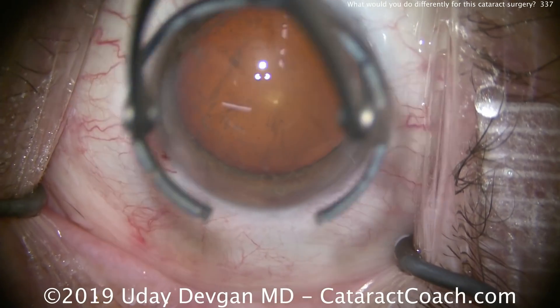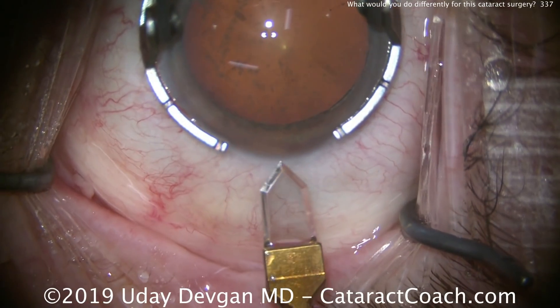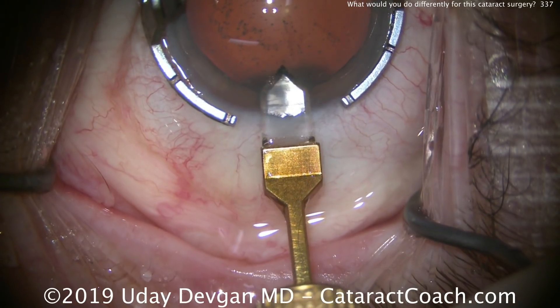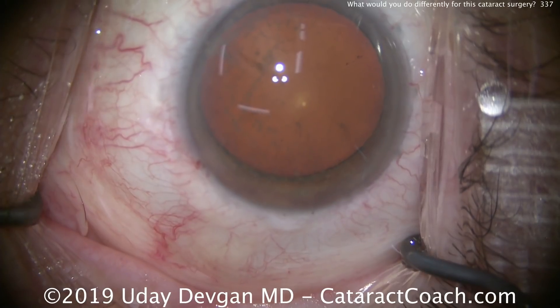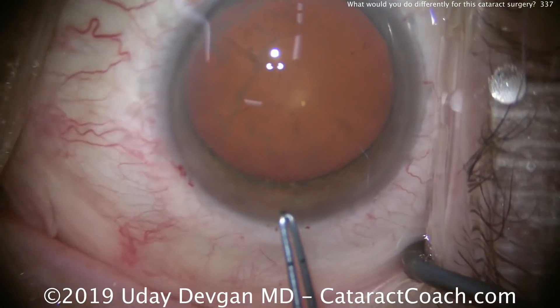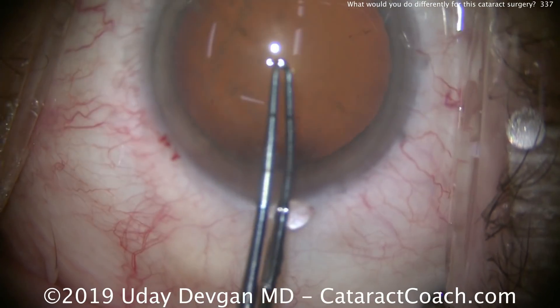But we intentionally trap some of these microscopic air bubbles against the corneal endothelium. That's going to allow us to directly visualize whether there's still dispersive viscoelastic present. We'll make our main incision here with a diamond keratome — that looks good, single plane, good tunnel length. As long as we still see those tiny bubbles there, we can be assured that there's a good protective coating of dispersive viscoelastic. There again, those are the bubbles we're looking at.